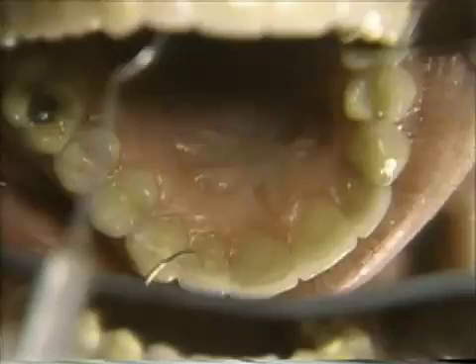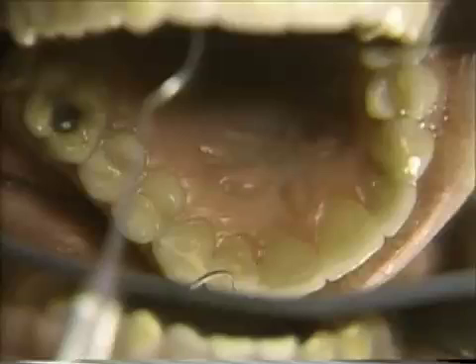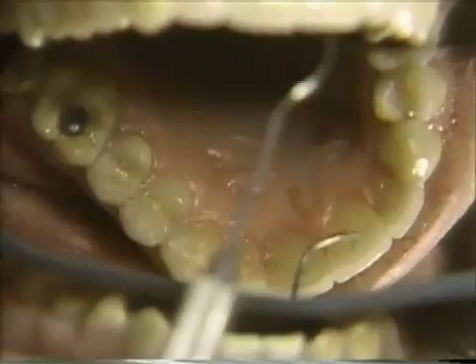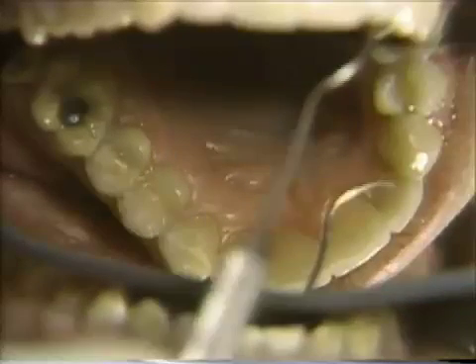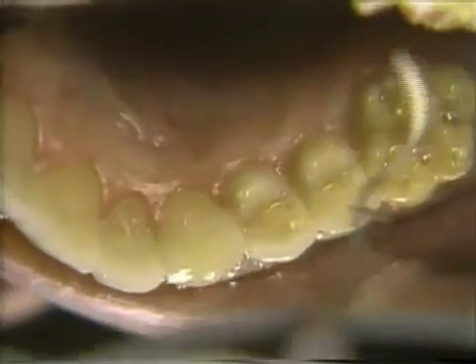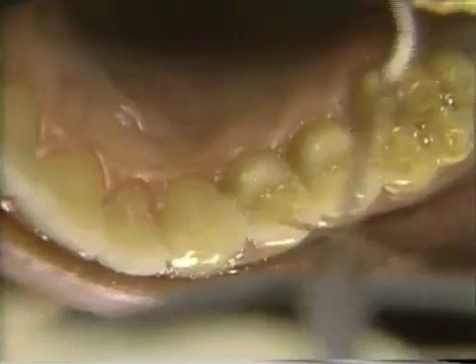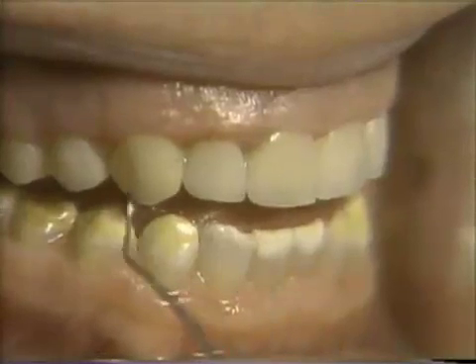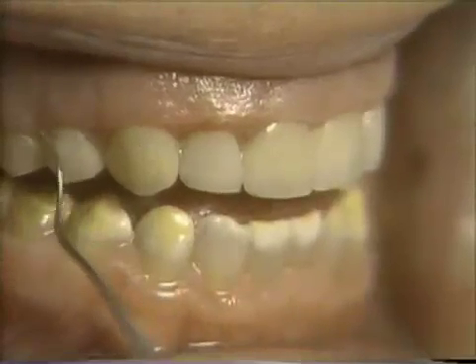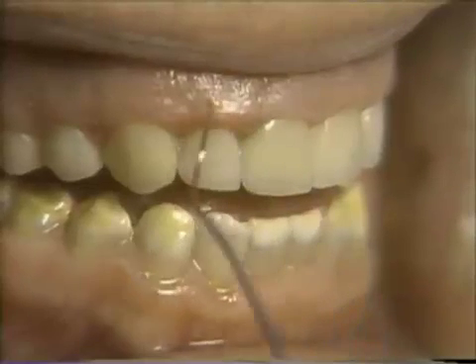I'd like to show you then the linguals of these restorations. You notice how nicely the margins are finished in so I can go from tooth to laminate without even feeling this. This has been polished and ground with a diamond, fine diamond, chamfer rubber wheels, and then diamond polishing paste — a very, very good finishing line here. Now on the cuspid and the bicuspid on the other side of the arch, you can again see how nicely these are finished in. Blended in, ground in and polished so that the patient has good excursions on these teeth and not undue force. We have duplicated the natural contours of the existing natural teeth — these are not bulky, not over-contoured. By reducing the enamel, we can restore this natural kind of contour, which is much kinder to the gingival tissue.